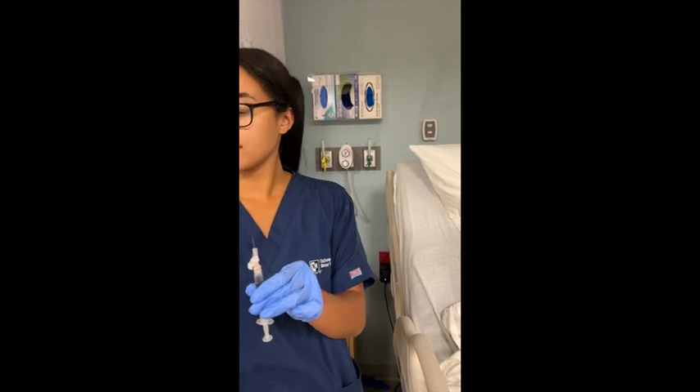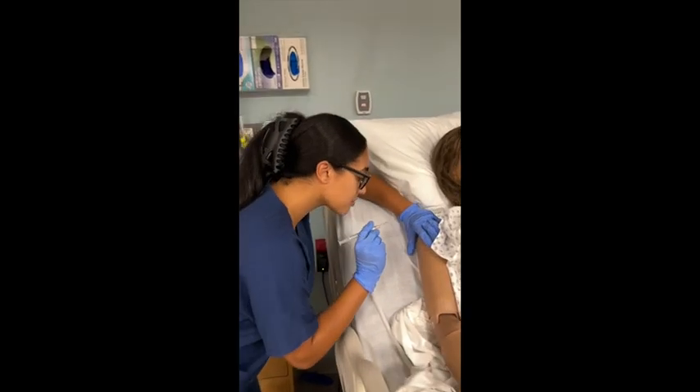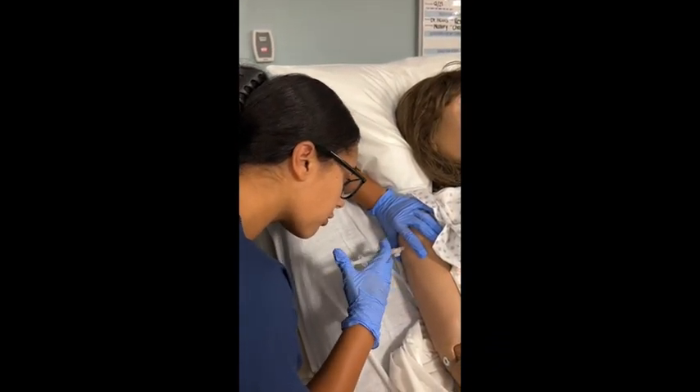Now that the site is cleansed and dry, remove the needle guard. Hold syringe in your dominant hand, spread the skin at the site with your non-dominant hand. Insert the needle quickly at a 90 degree angle to the patient's skin surface. Slowly inject the medication.